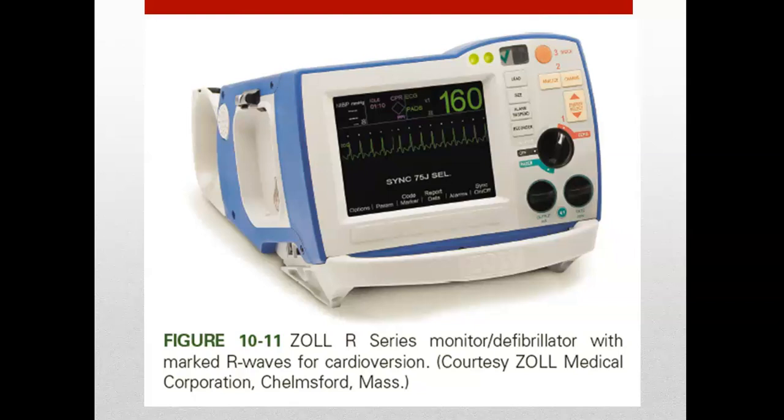So, Miss Fleming has a little Zoll monitor, and I'll see if I can get it from her Monday morning and bring it to you guys to show how we would do that, because it legit looks like a little Zoll monitor, and you just press it and it does the thing, and you can change the joules.